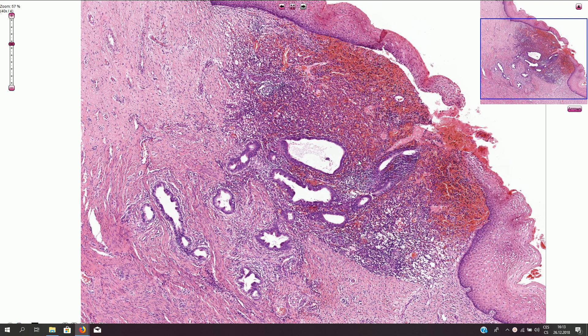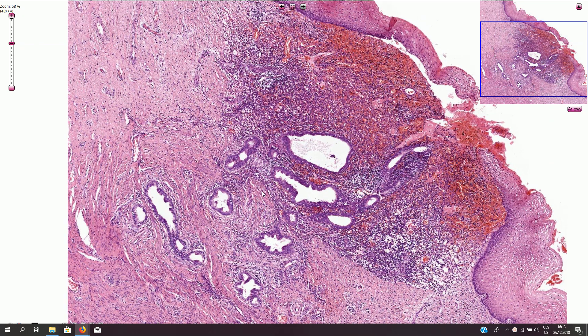In order to diagnose endometriosis morphologically, we should always see all three components.